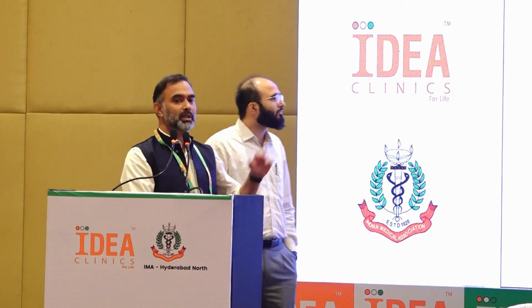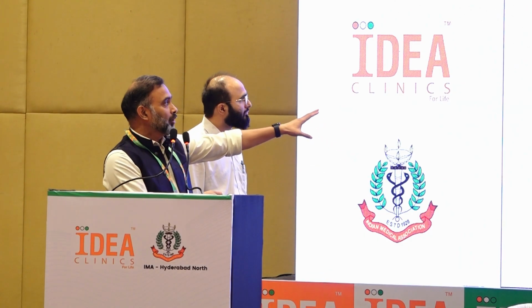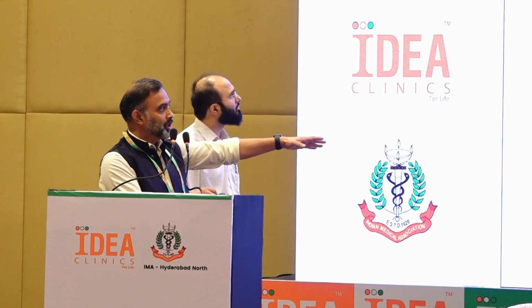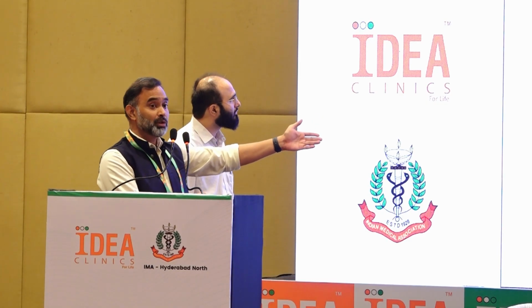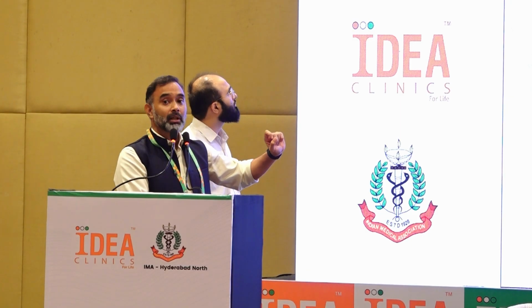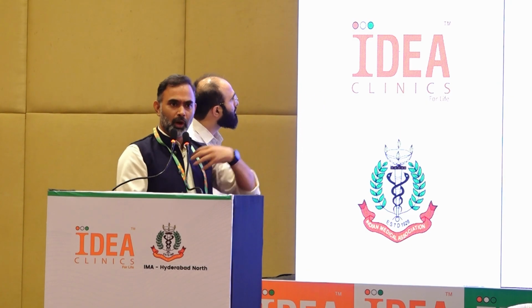Yeah. So this is what we actually look at when we see the patient. I see how much insulin is being delivered, what is the coefficient of variation, how much bolus they have given. I caught a lot of cheaters on this as well, where they don't take the insulin pumps. There are 3 settings we have to put initially.